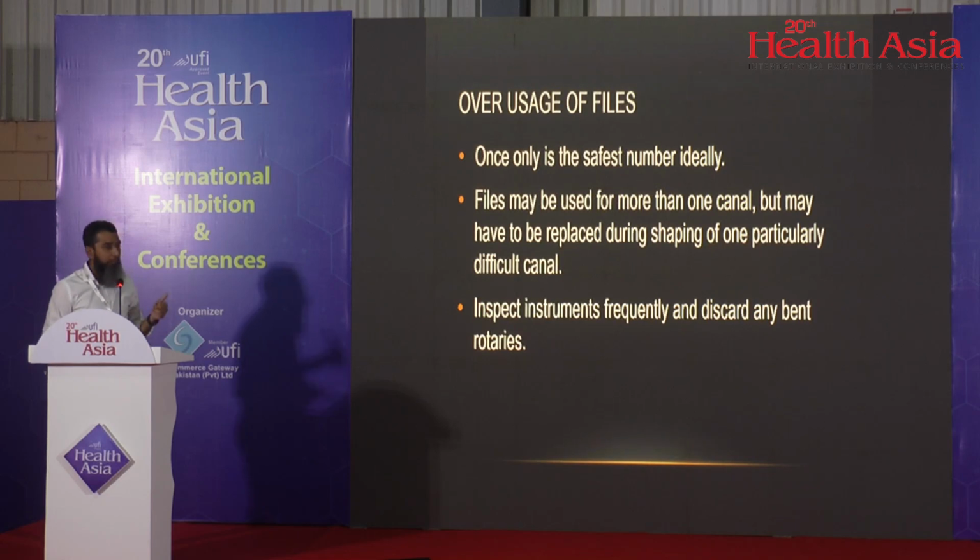But like I told you with Rotary, the most common problem is of file separation. And the main reason for it is overusage of files.